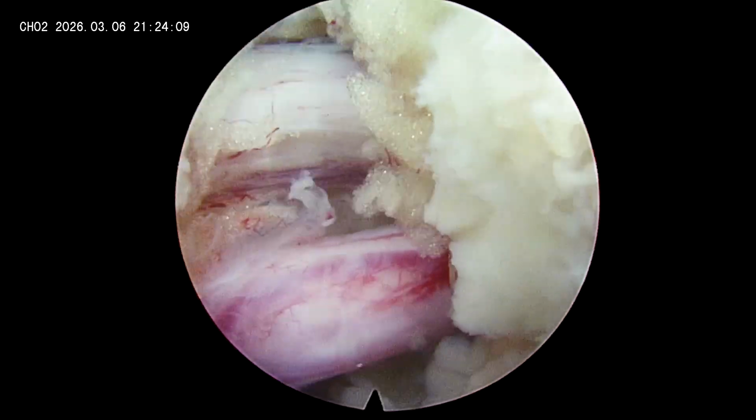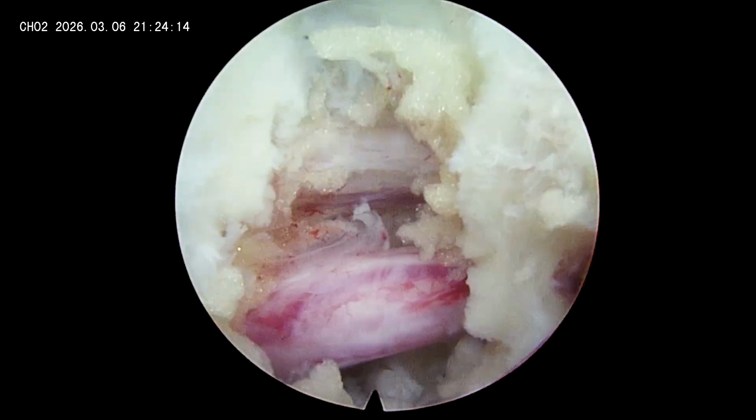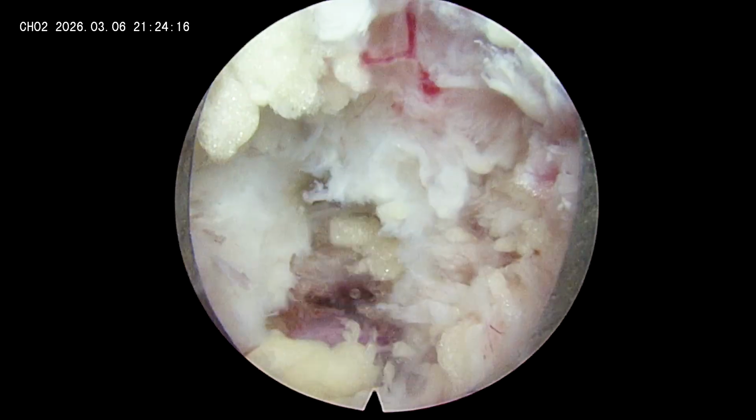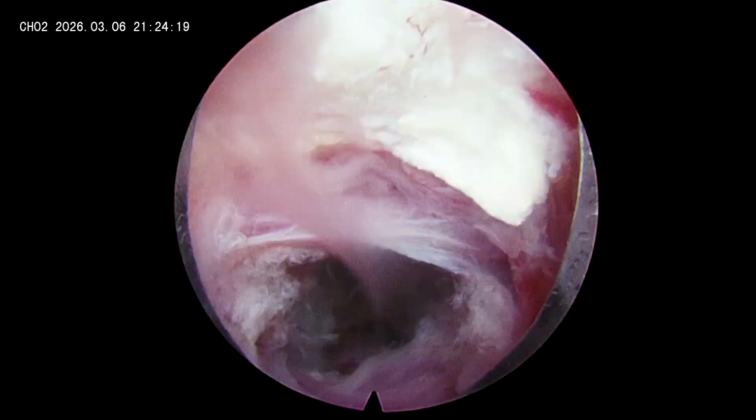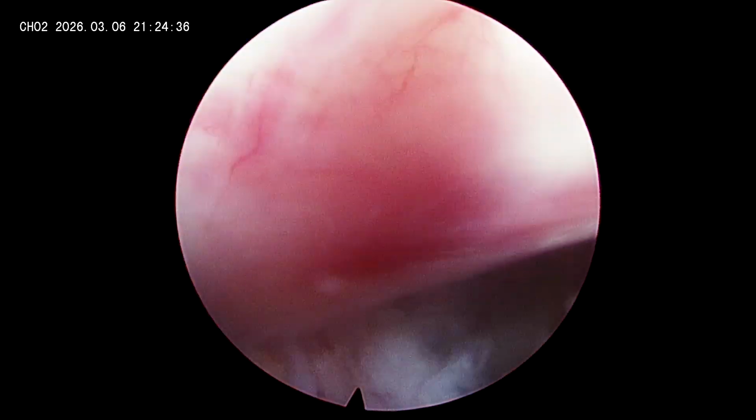So this is the root which is free. You can see the congestion of the root. I can easily retract the root. Now you can see I am withdrawing and everything is literally falling back. All the soft tissues and muscle are falling back. So the incision is not more than 6 to 7 millimeters in this case. So we have finished our surgery. This is the kind of surgery every beginner should start with.